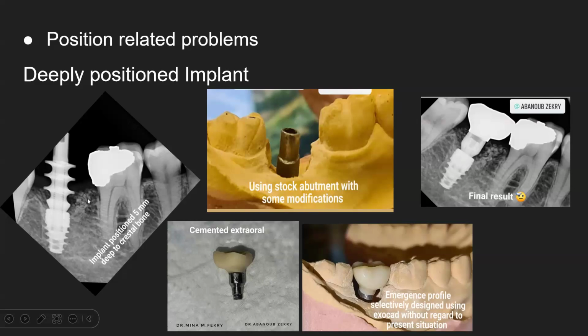Also, you will face a problem with a closed tray impression because a closed tray impression needs to be embedded in your impression afterwards. And the emerging part from the gingiva is still too short to be embedded with the same direction. You may have a wrong impression. So I guess in deep implant, your only choice is to use the open tray impression technique like we do here.